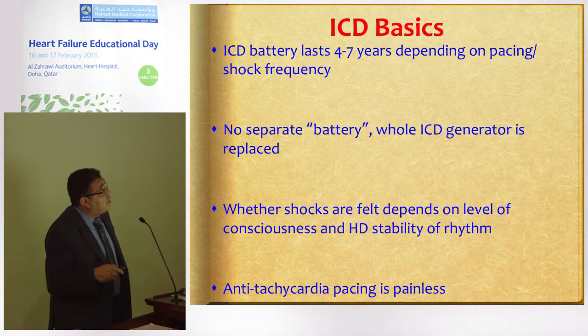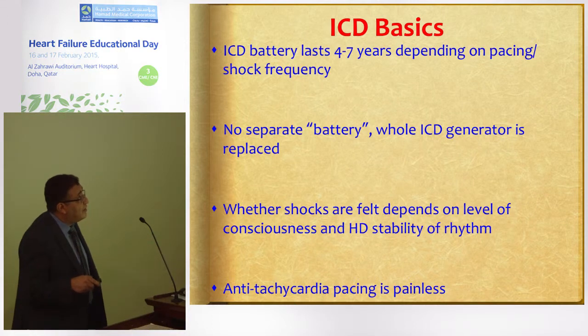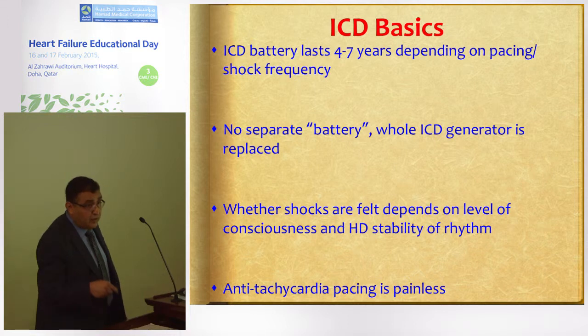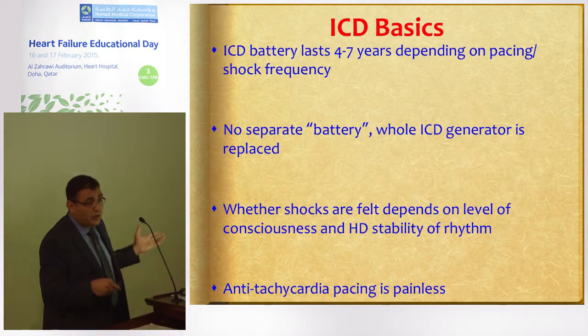ICD batteries last for 4 to 7 years, depending on the pacing and shock frequency, but the newer devices can last up to 10 years. Some companies are saying maybe 12 years. There is no separate battery. The whole ICD generator needs to be replaced. It is not rechargeable from outside.